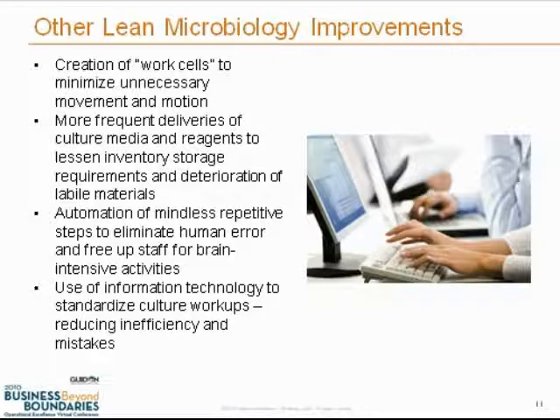Another change is more frequent deliveries of culture media and reagents to lessen the amount of inventory in storage. That means we have less requirement for storage space, and we see less deterioration of labile materials such as culture media. This is addressing that flow principle that I mentioned a couple of slides ago.